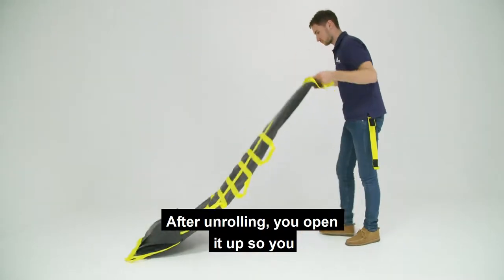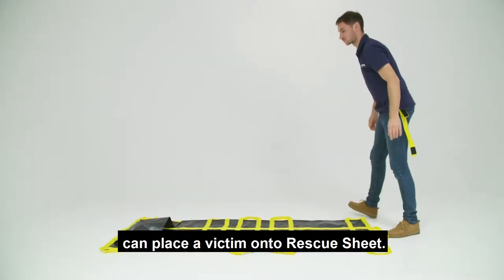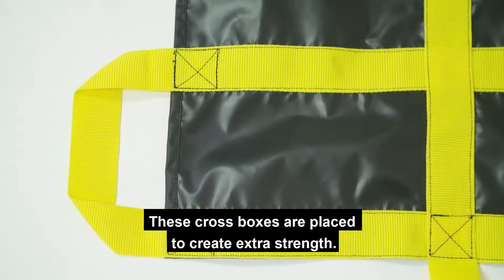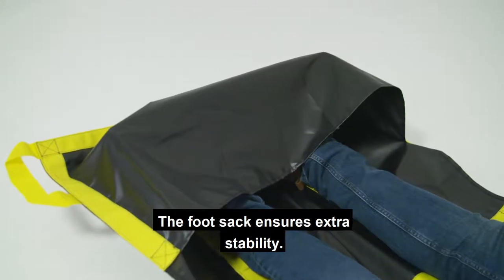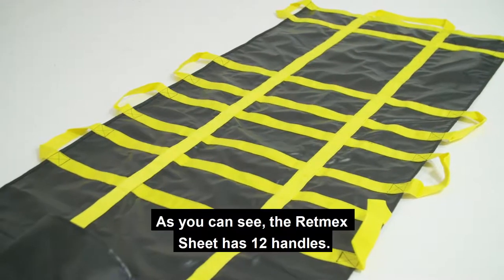After unrolling, you open it up so you can place a victim onto the rescue sheet. These cross boxes are placed to create extra strength. The foot sack ensures extra stability.